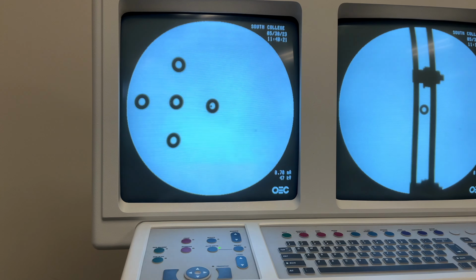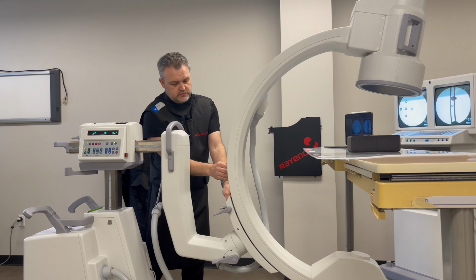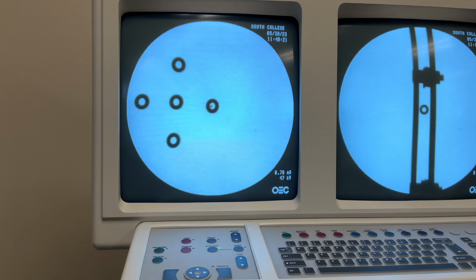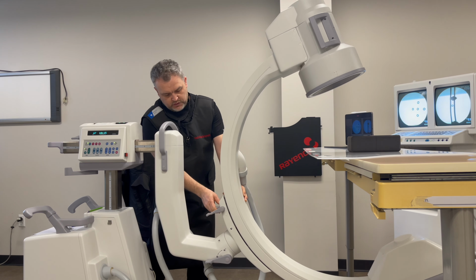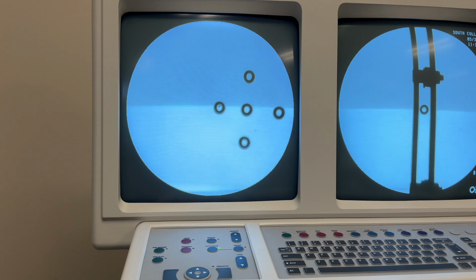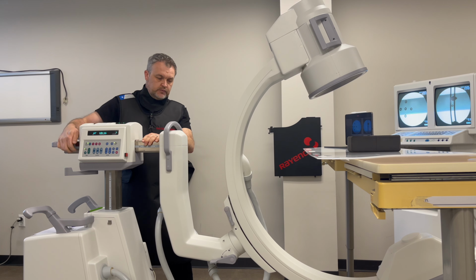To go back and forth between those, from one oblique all the way over to the next, we'll go ahead and sweep on up. And picture. Again, BB's there. Let's come back. Again, the washer is displayed. And finally back on up to the AP.